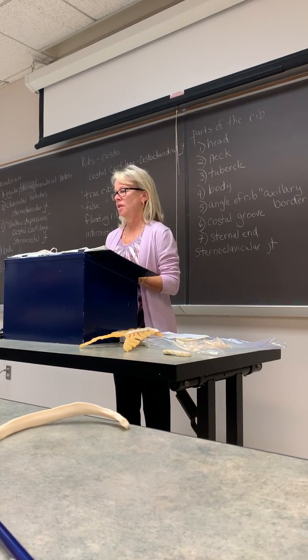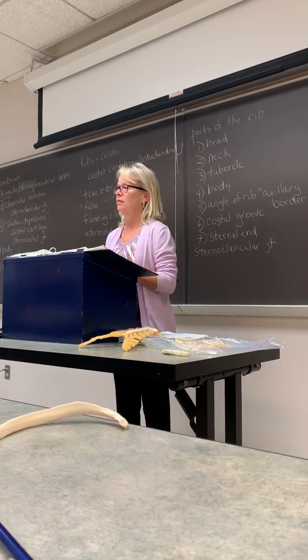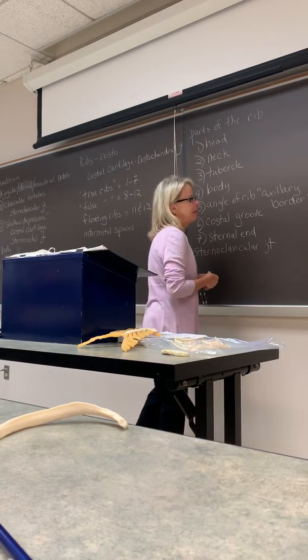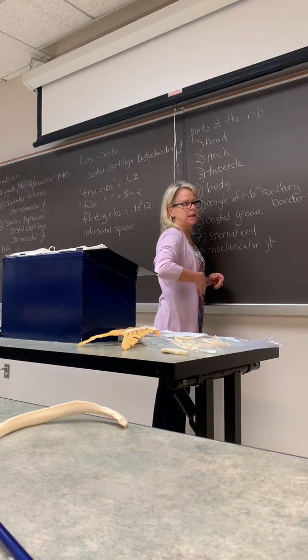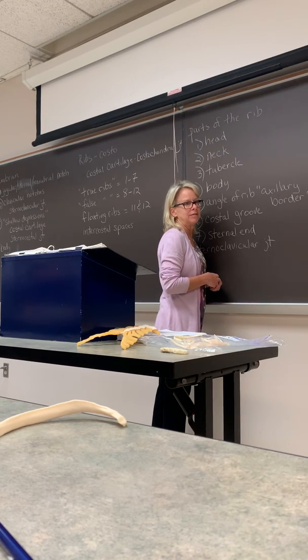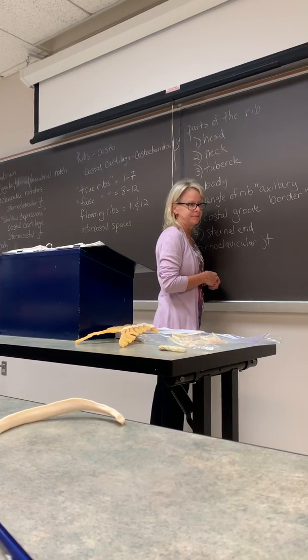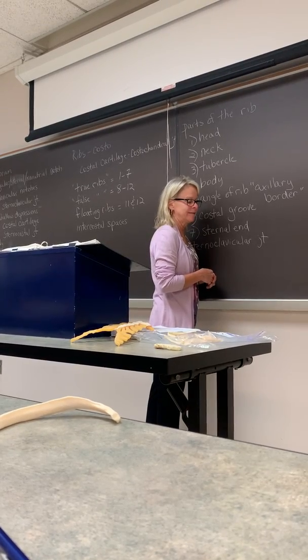What do you think it is with AOs? It's the exact opposite. So if LAO, it demonstrates the right ribs elongated. You thought you were over it with the spine stuff.